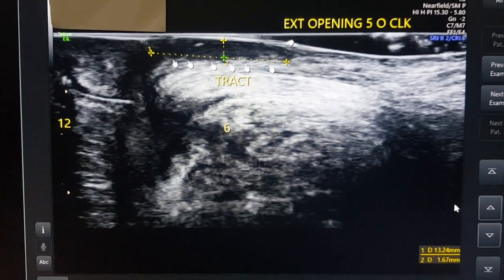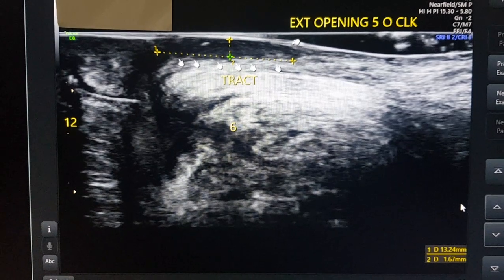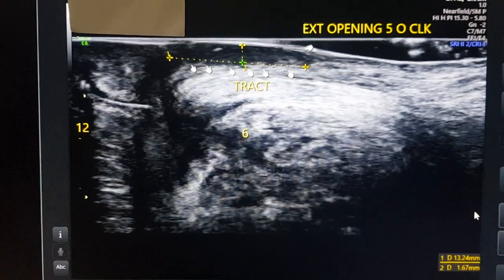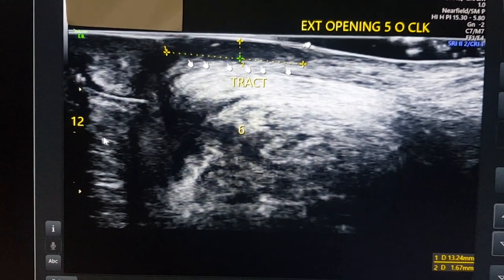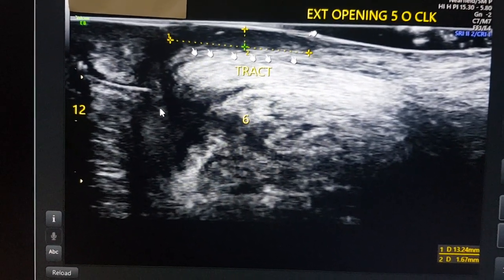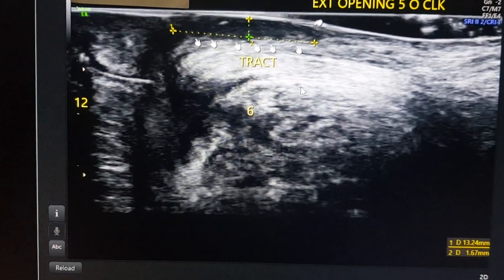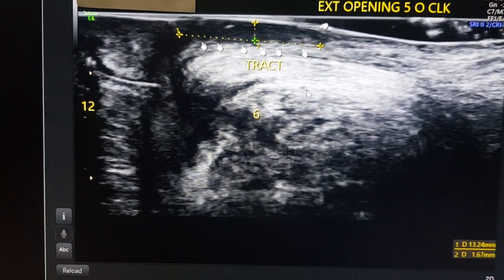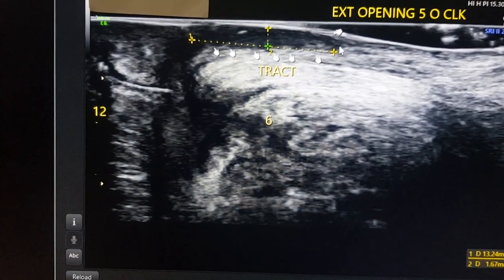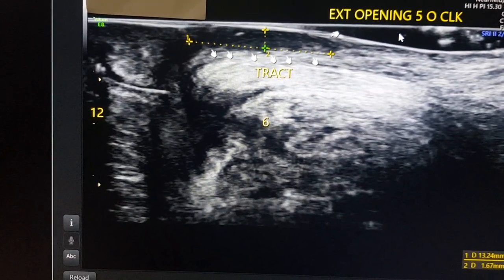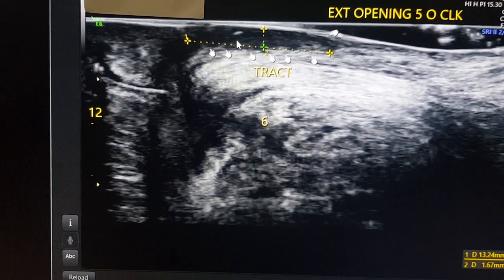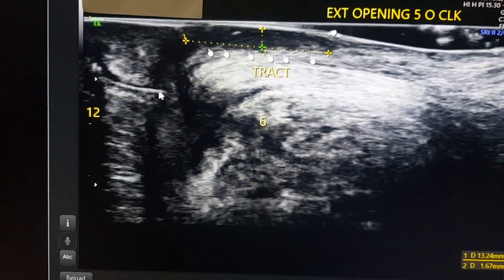You can see here that this is the 12 o'clock position and this is the 6 o'clock position. The high-frequency linear probe is in a sagittal plane. I can see the external opening here — that is the skin, that is the external opening at 5 o'clock position — and from here a tract goes in the subcutaneous plane towards the anal canal.